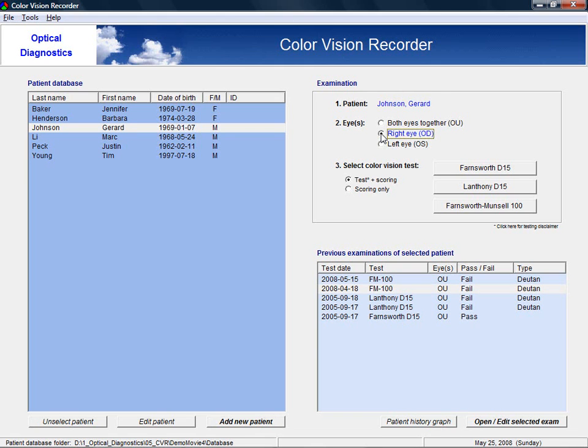Select if you want to do an actual color vision test with the computer or just want to use the software for scoring only. And finally, choose the color vision test to be run.